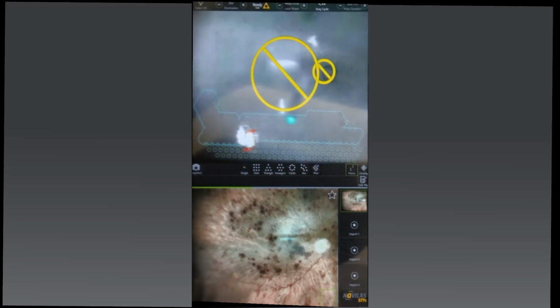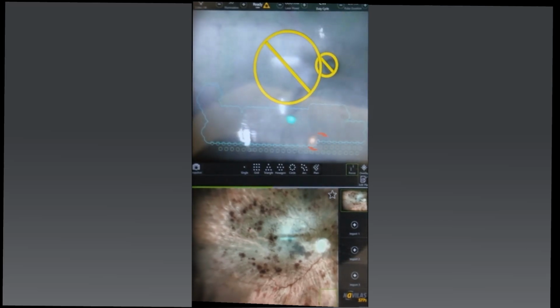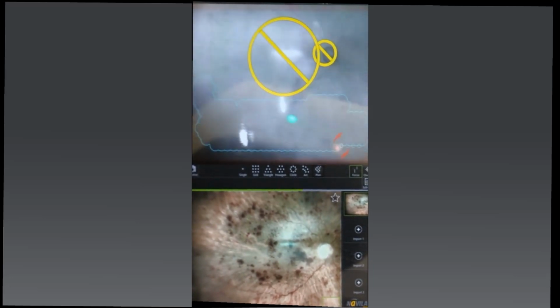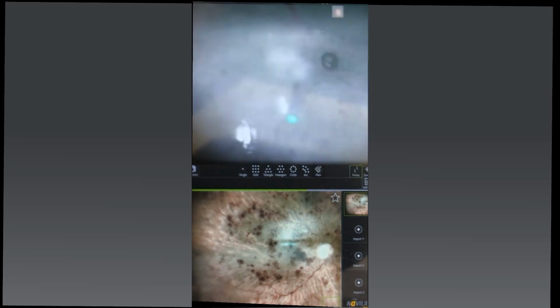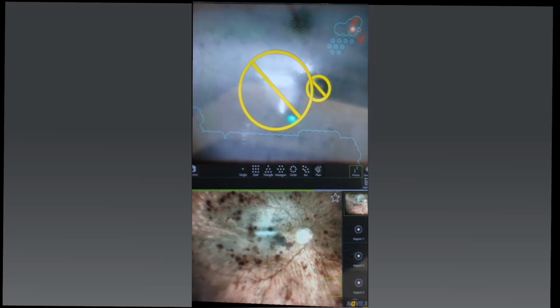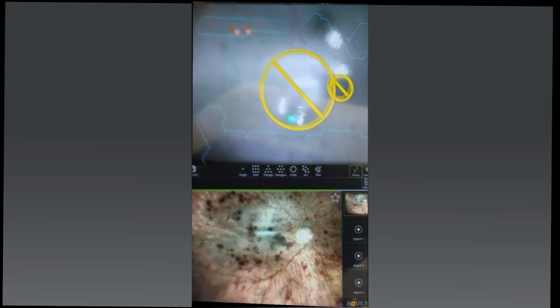I've had the odd instance where the ability of the Navilas to register with the infrared is temporarily impaired. So I just tend to switch back to color mode then, and immediately the map will appear and you can carry on treating. So that happens now and then. You can toggle between the two quite easily. And sometimes if you've got an area that's difficult to visualize, it's really nice to be able to just switch back to the color mode temporarily. And you can obviously gauge your treatment effect as well at the same time.